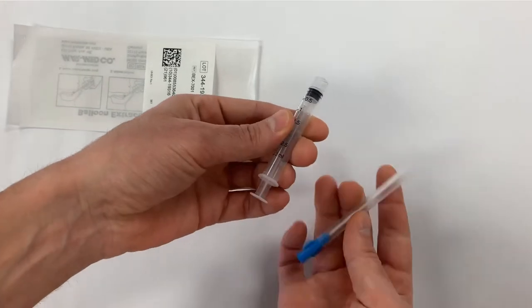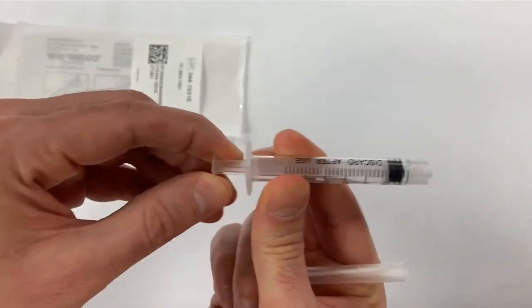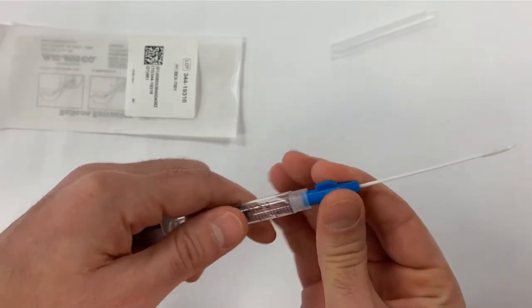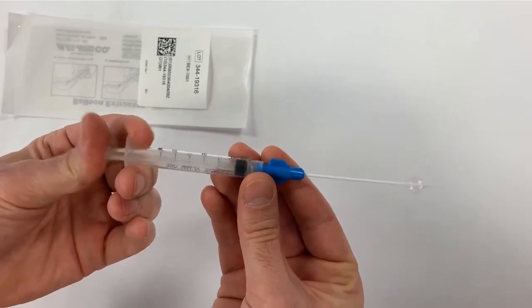After opening the package, you'll find the syringe and balloon catheter components. The syringe is marked at one and a half cc so that it cannot be overinflated. Once the syringe is open and the cover removed, you can screw the pieces together and inflate the balloon.